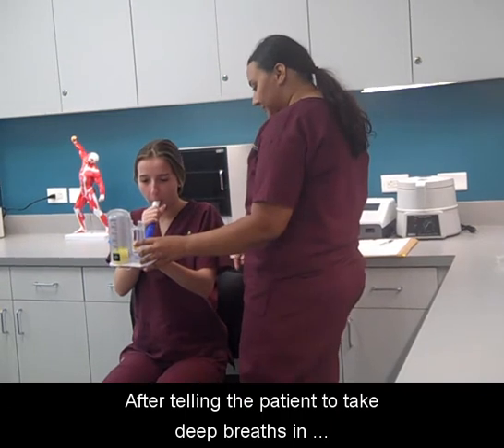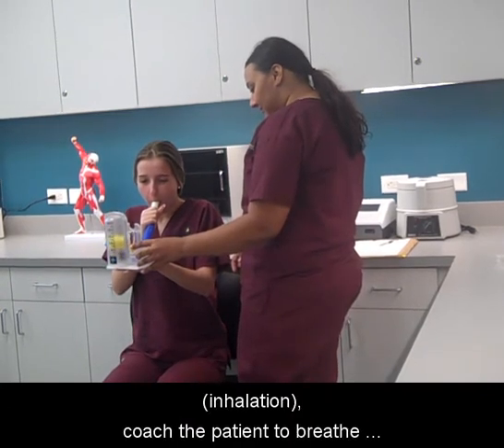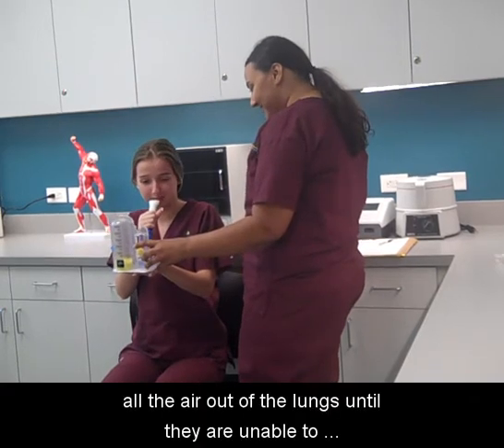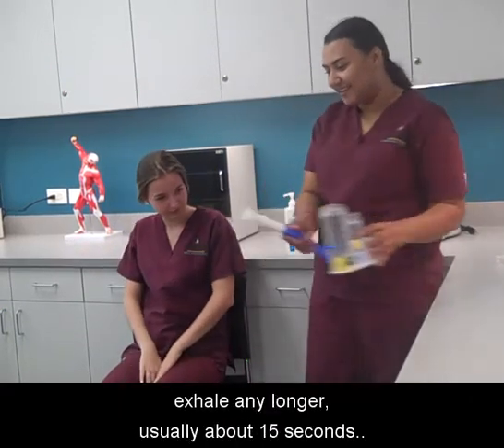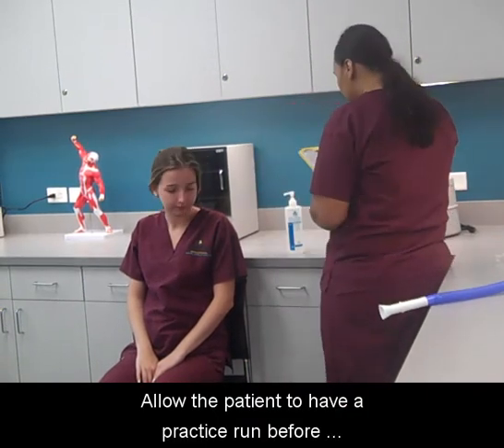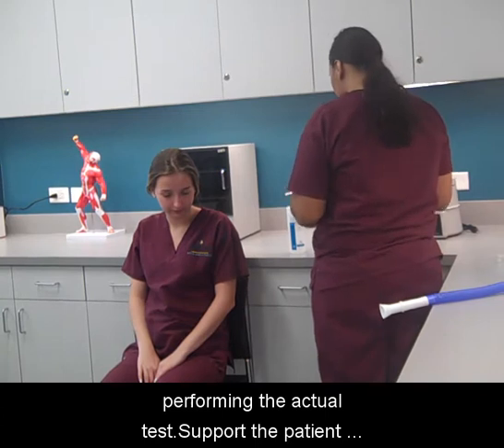After telling the patient to take a deep breath in, coach the patient to breathe all the air out of the lungs until they are unable to exhale any longer, usually about 15 seconds. Allow the patient to have a practice run before performing the actual test.